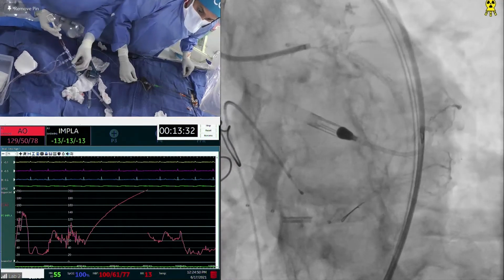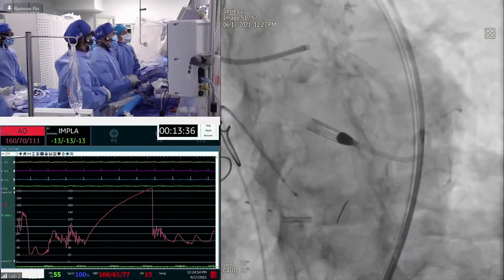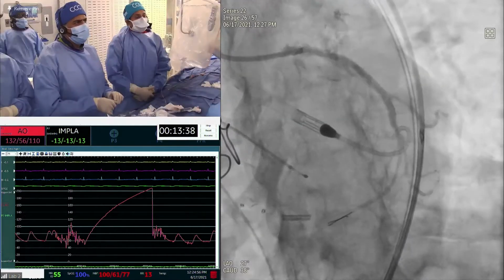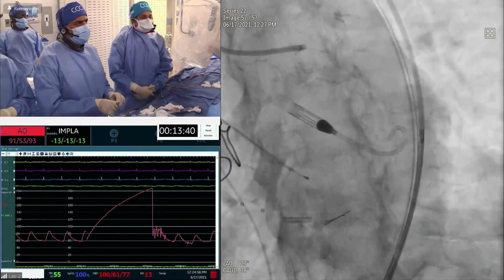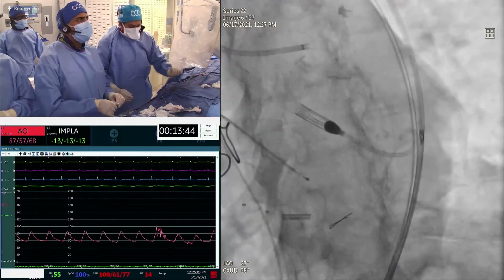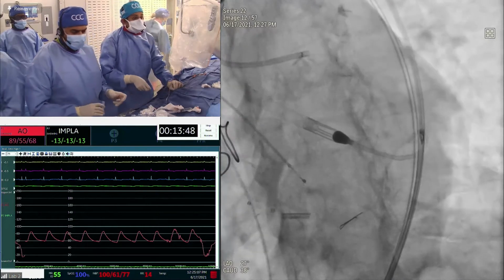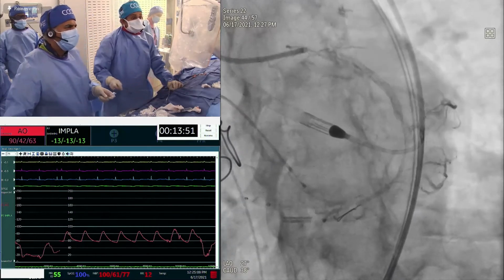Yeah. All right. Wow. I think very good. Excellent. The rest become a little simpler. We'll be ready for the other side. Well, we will put a 12 millimeter 3.5 coming into the left main, post dilate everything. Any questions for us before you go to the other side? I still worry a little bit about the outflow of the stent. Anybody else feel good about this? Everybody feels good. I think it looks great.